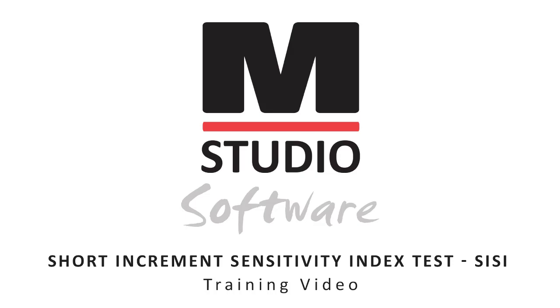Today we are going to review the Short Increment Sensitivity Index Test and how to perform that test within the Medrex Studio software.